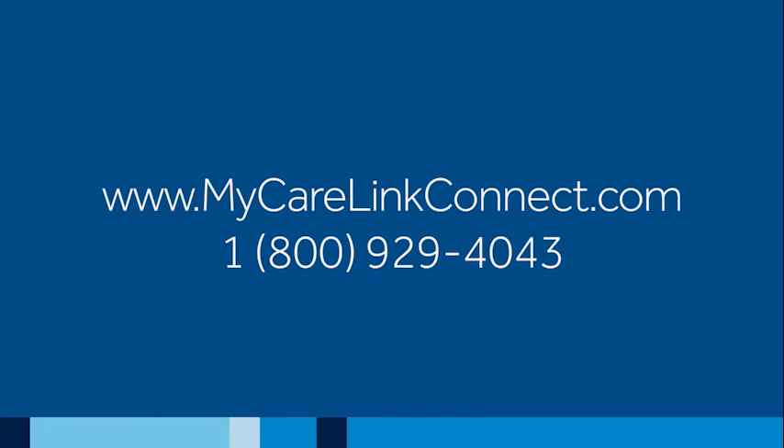That's all there is to it. Your CareLink monitor is now set up to transmit your heart device information over the internet. For future transmissions, continue to follow your clinic's instructions. If you have questions that were not answered in this video, you can find help at the website shown on the screen or by calling the number shown below it. If you need to review these steps, just replay the video and watch again.